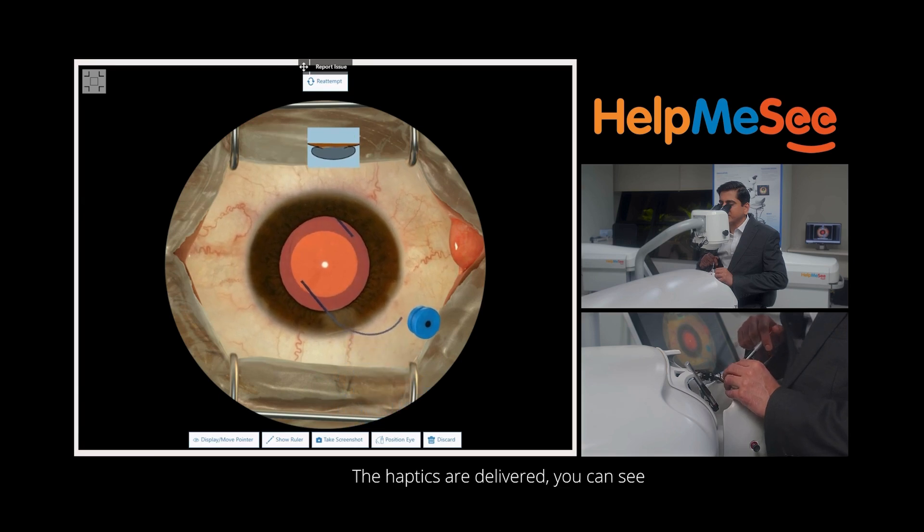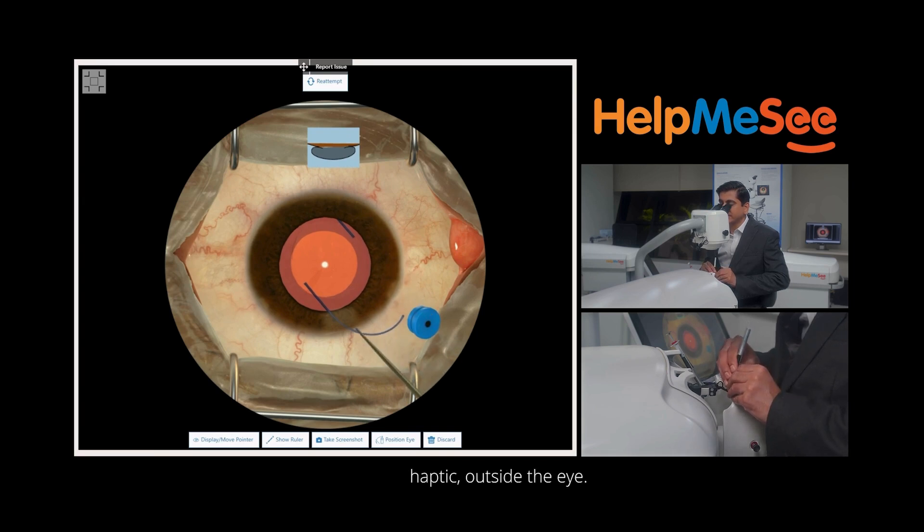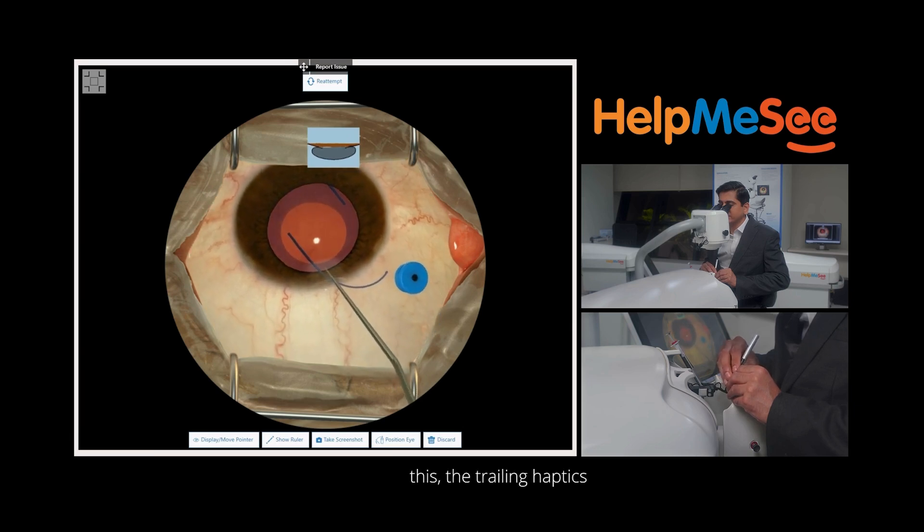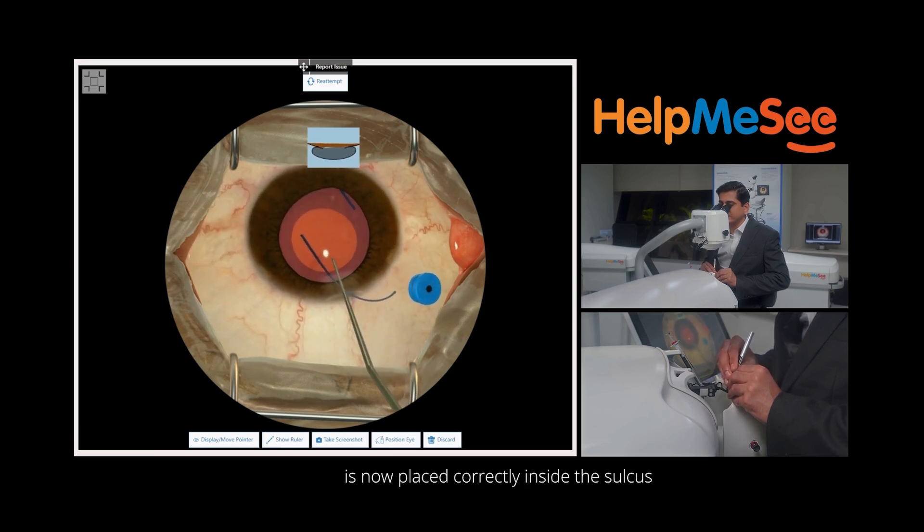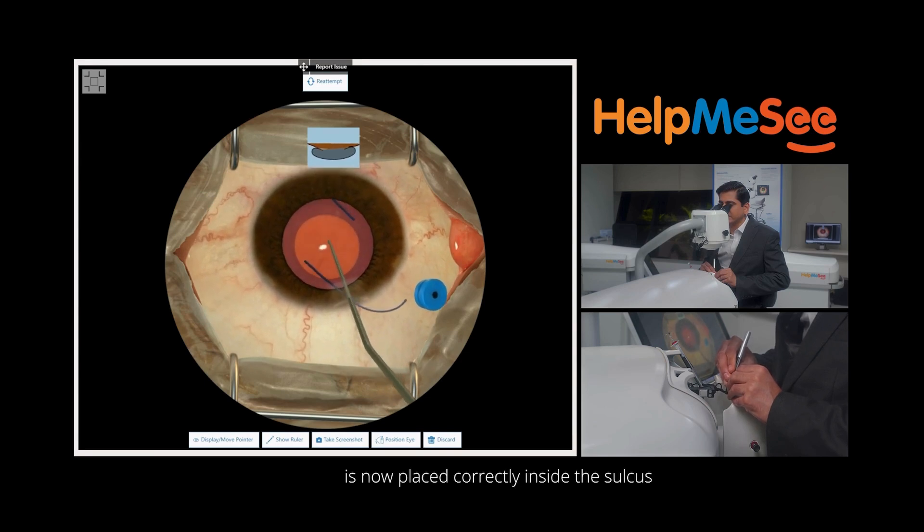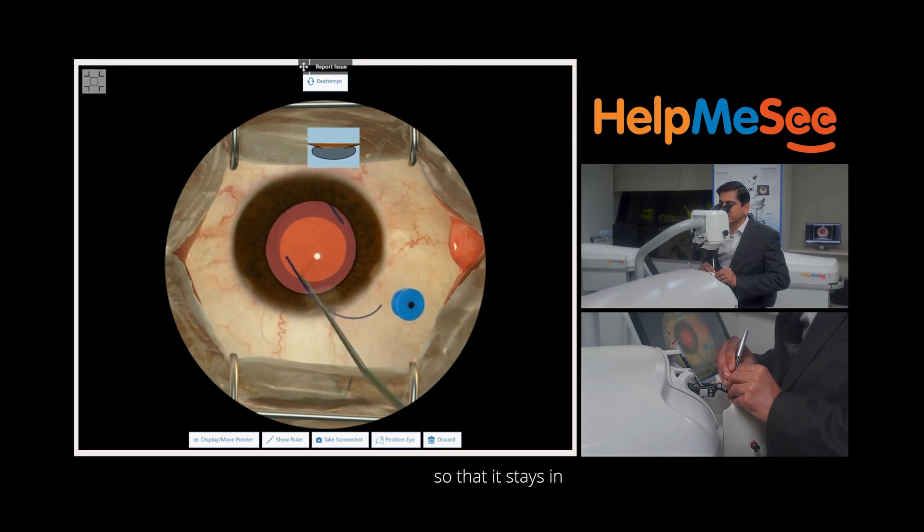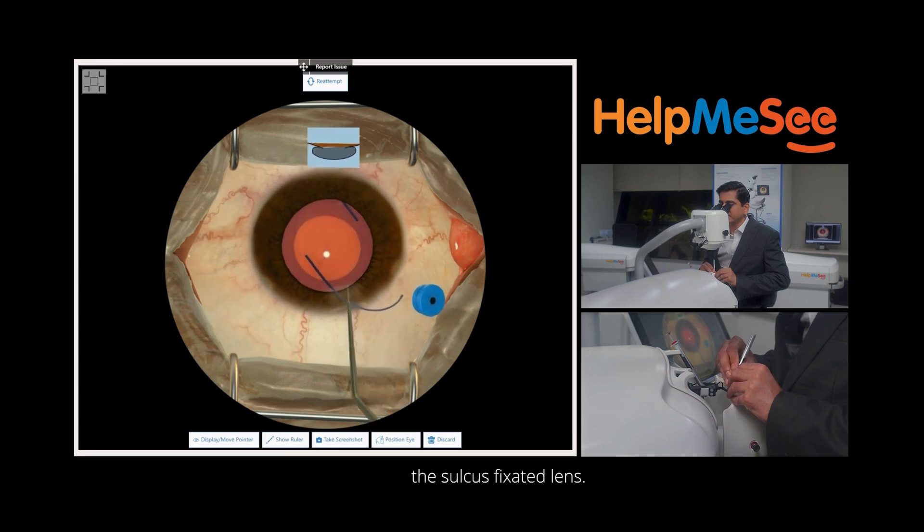The haptics are delivered. You can see that the lens is nicely delivered with the trailing haptic outside the eye. We have to dial it inside and ensure that once we have dialed this, the trailing haptic is now placed correctly inside the sulcus so that it stays as the sulcus fixated lens.